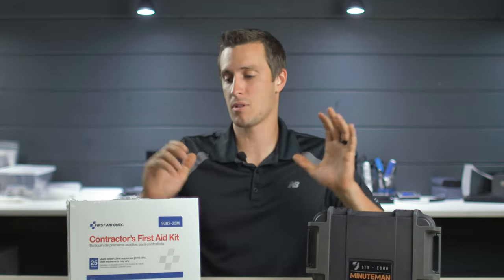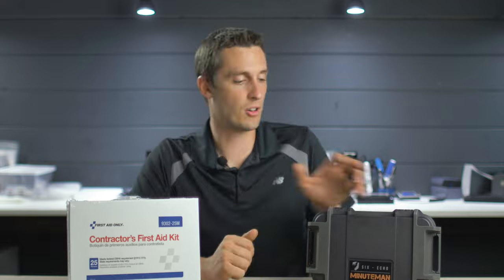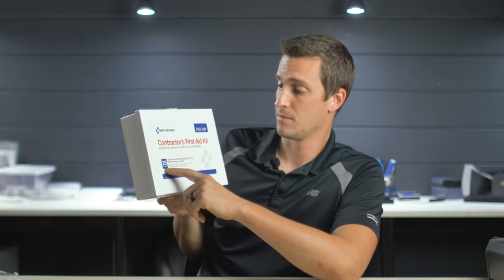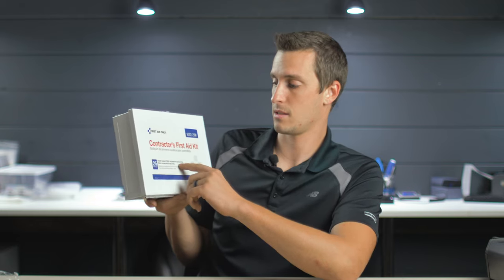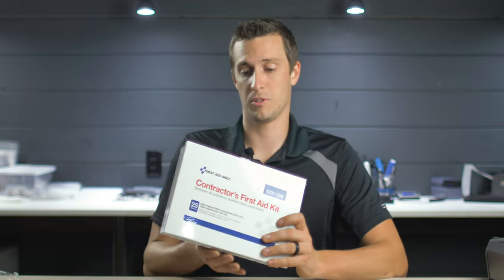Before I rant any more about the price-to-pieces ratio, let's break these open and see what's inside. First up is this contractor's first aid kit made by First Aid Only — it's a 25-person kit. I looked up the OSHA regulations and the comparable list in here was good for two to three people, but apparently this is a 25-person kit that meets federal OSHA requirements. So we have 100 band-aids — hope no one needs more than four band-aids each.